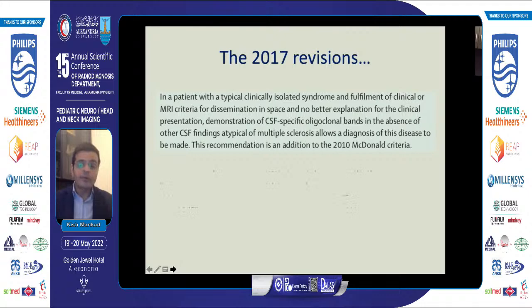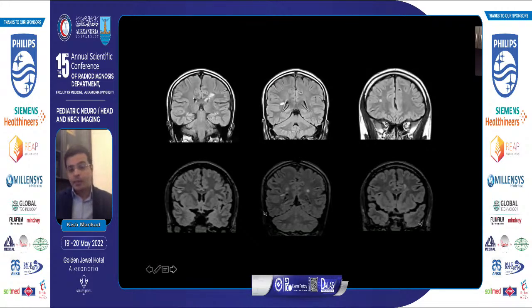People would give steroids and the overall outcomes are good. Compared to that is this scenario. Now, this patient presented with headaches. They were scanned only for headaches. There was no encephalopathy. There was no fatigue and other things. It was completely a headache scan.